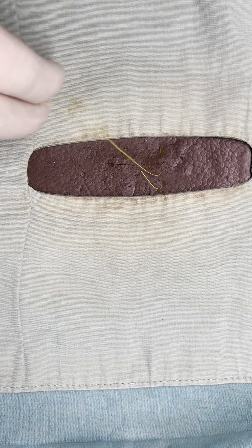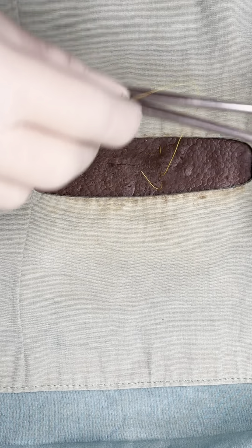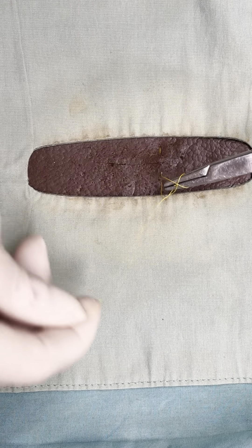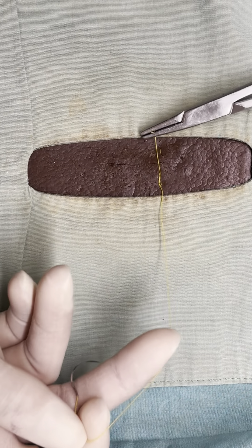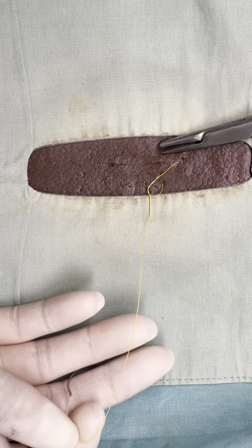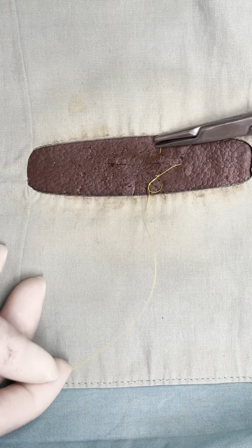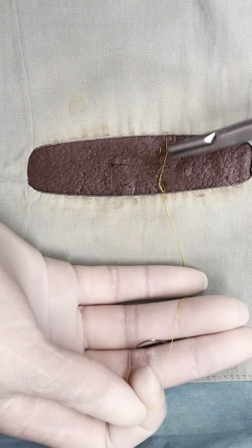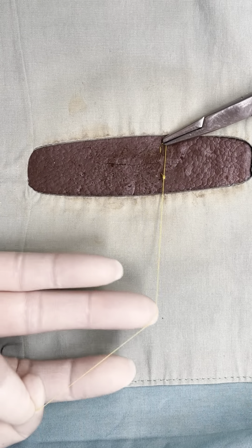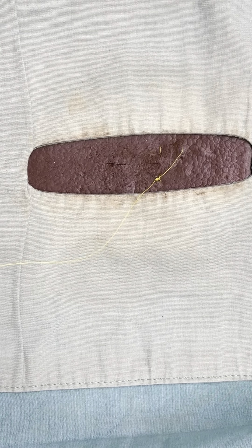Now my short and long end are on the same side. We're going to do that surgeon's knot and tie exactly like we did with all of our other ones. We're going to shimmy it until it lays nice and flat, not making it too tight. There we go — and then two square knots, and then cut.